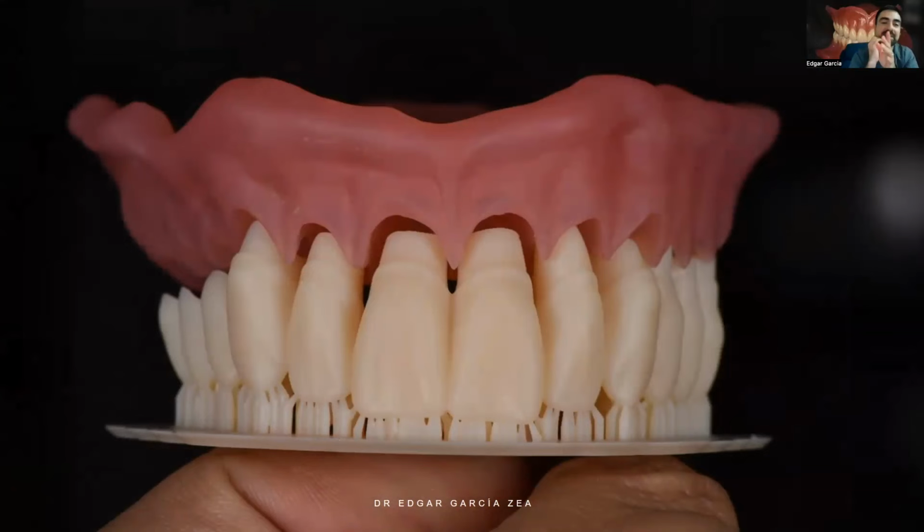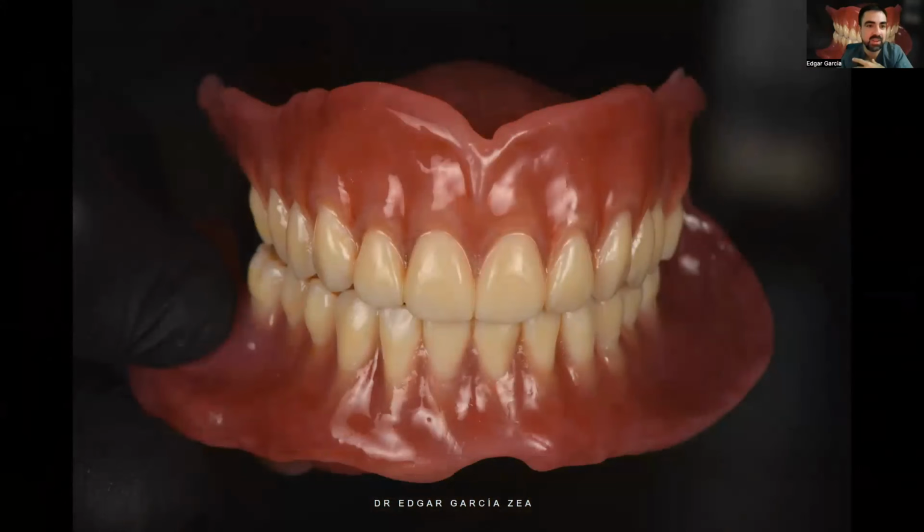But also, talking about Latin America, as a consequence of not taking removable prosthesis to the level of importance, we have a lack of the amount of teeth that we can use. So it's not an option for me to do this kind of design. So I prefer to print everything. Also, I have much support that this kind of resin is at the same level, even in some properties better, than the classical teeth that we use in conventional dentures.